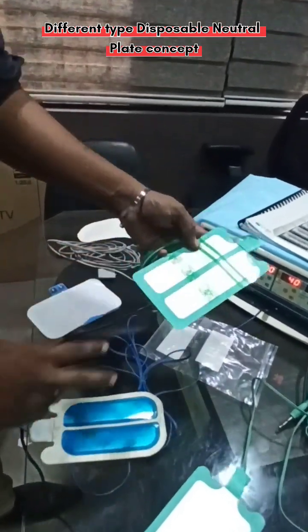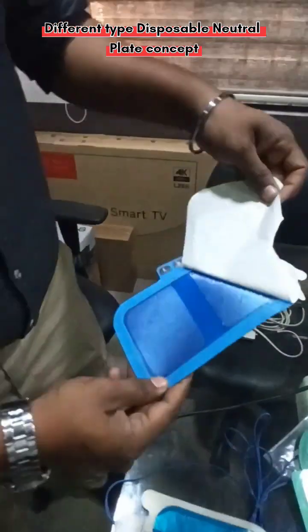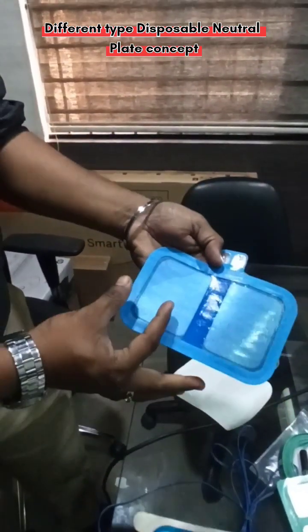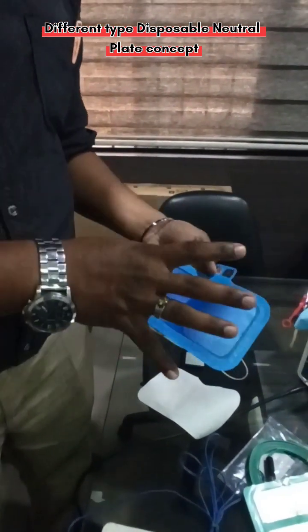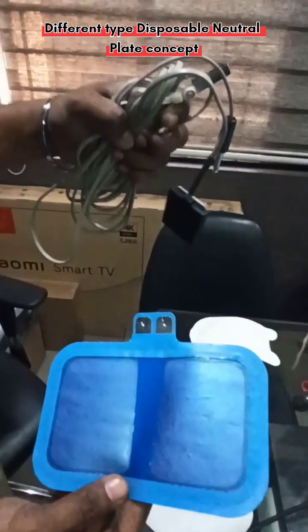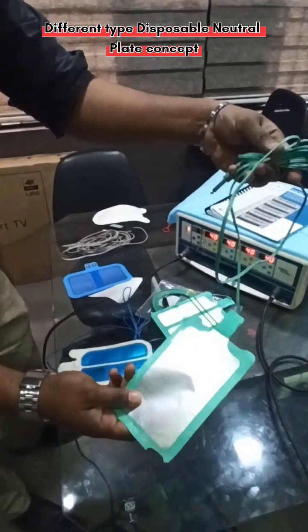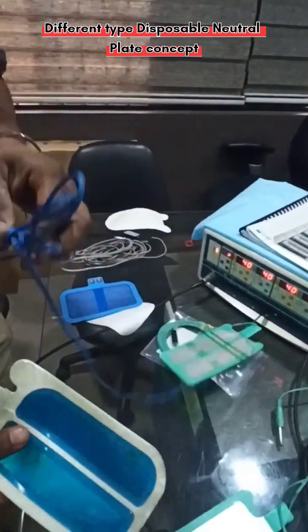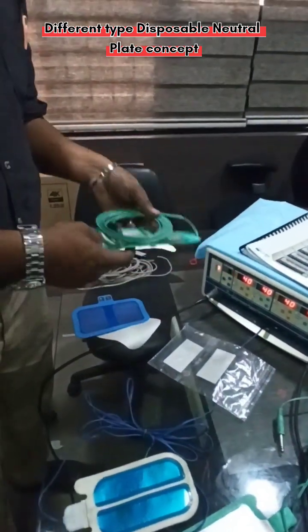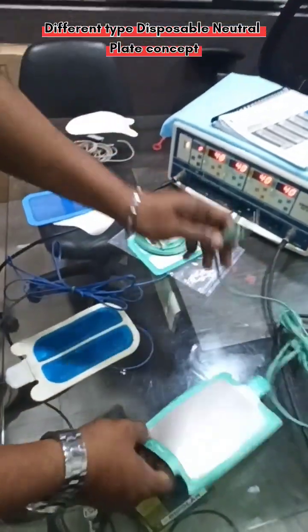This green one also has two sections. If you take the blue one, you can see it is fully blue with two sections — one section on each side. This kind of plate is called a split-type earth plate. When using this type, you need a cable. You can see the cable is molded here — we cannot remove it. Once it is used, you have to throw it out because these are disposable earth plates, also called patient plates.